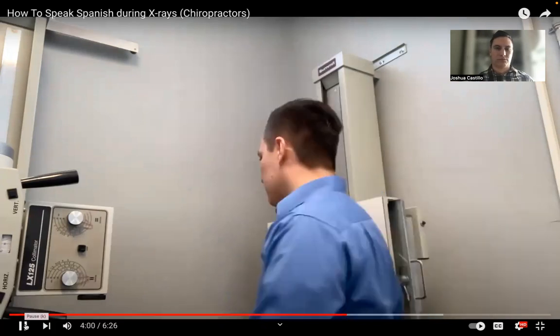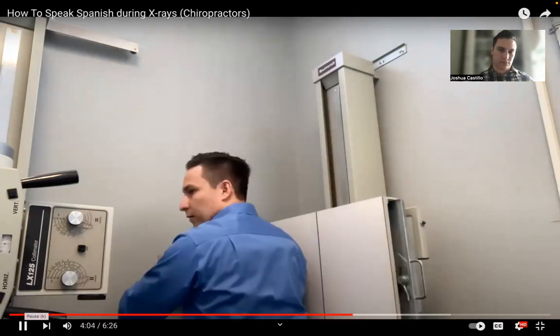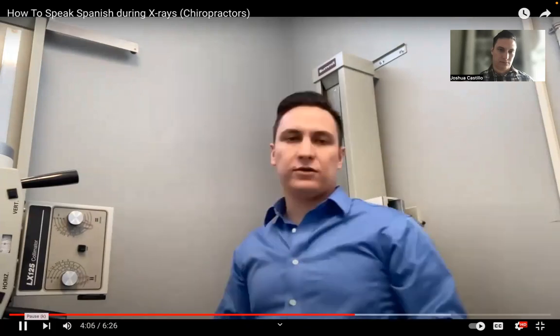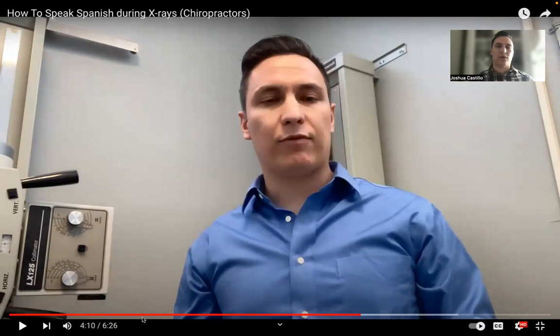And then you would position everything, make sure, right, they're either forward or backward. So you're going to use those commands of atrás or adelante, más adelante. And what's cool is if you don't want to use hombros así, at the end of the day, remember guys, just repite. However you have them positioned, just tell them and then just say repite. I use that all day.